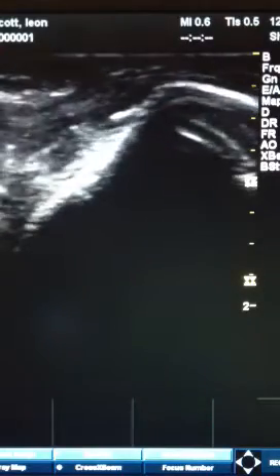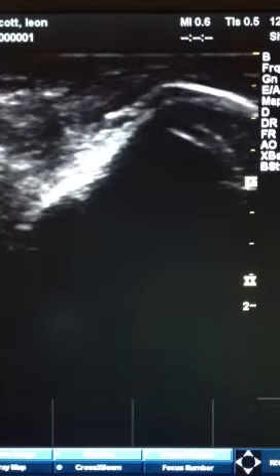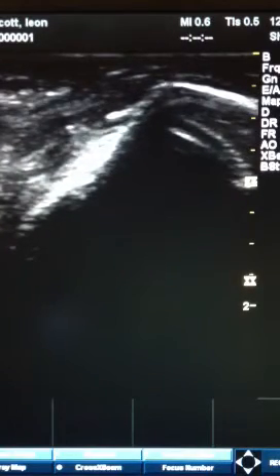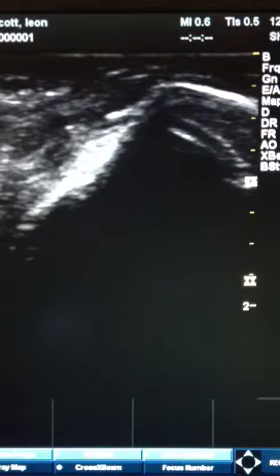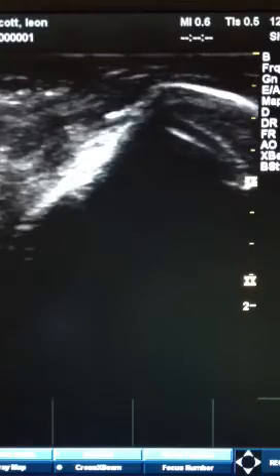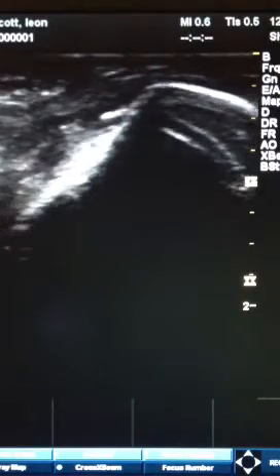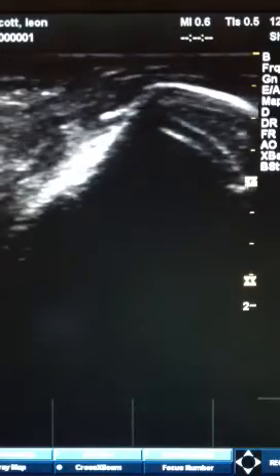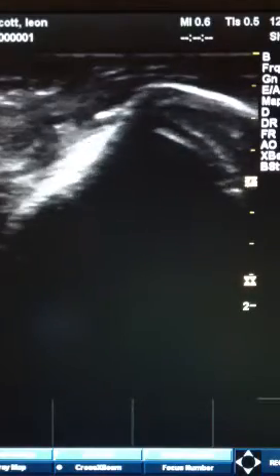In looking at that, I think that is a piece of calcium — some calcium on the tendon — and that would be consistent. Also, you can't see it so well in this view, but there's some space around the calcium and that looks like tendinopathy, or injury to the tendon.